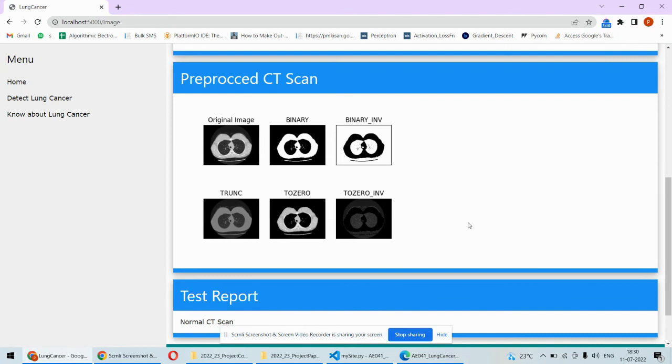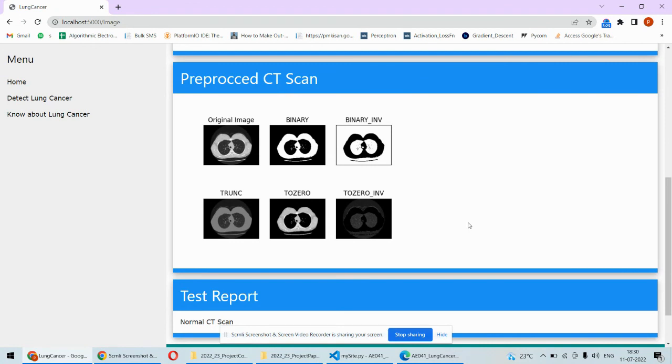So this way we can actually detect the lung cancer from the CT scan from the patient. This kind of system any patient can use to upload his CT scan and then anybody can diagnose himself from this particular web tool.